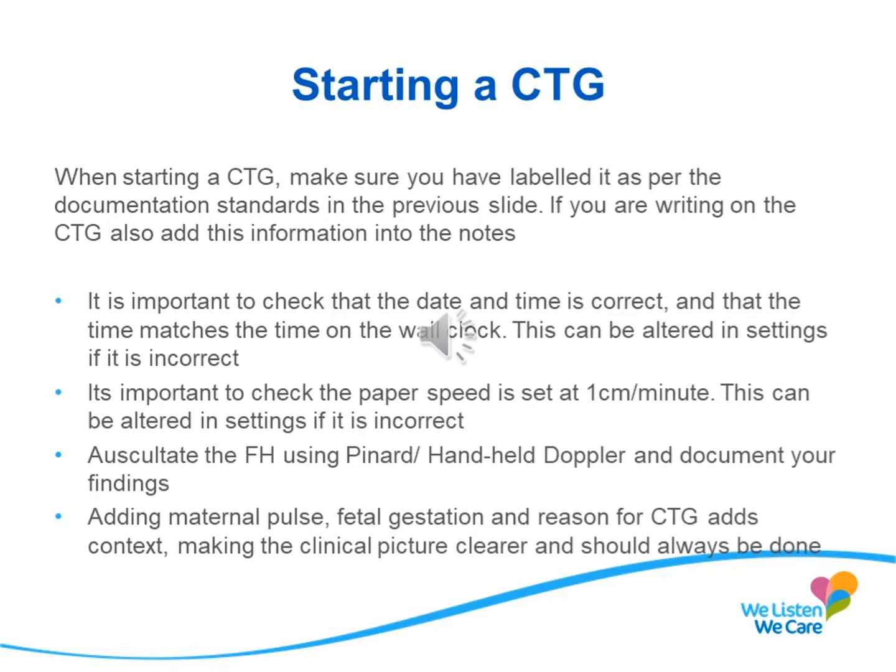Documenting the mother's pulse, the fetal gestation and the reason you're doing the CTG adds context to the CTG interpretation and should always be done.